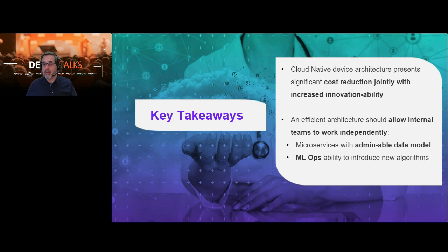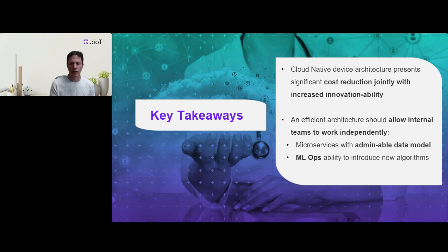A broader question was, what are the needed device specs to be hosted on your platform? Actually, any kind of device, from a very, very tiny device with no operating system at all to even large machines, surgical machines that are installed in hospitals and running Windows and the like. Anything goes. Of course, a device with a smaller footprint will usually use the MQTT protocol, which is very lightweight. They may not be able to use the APIs.